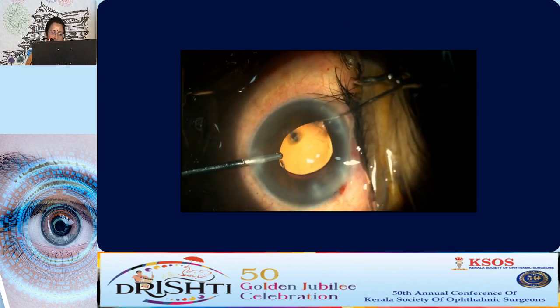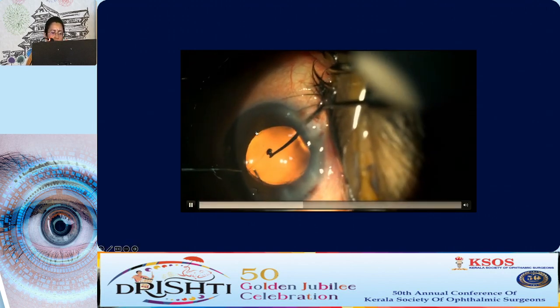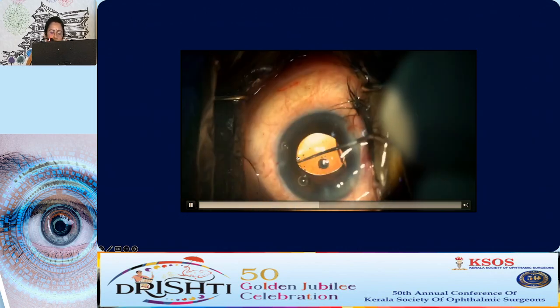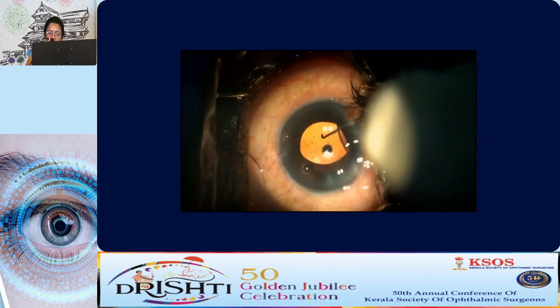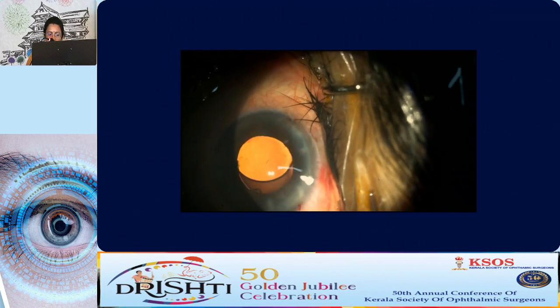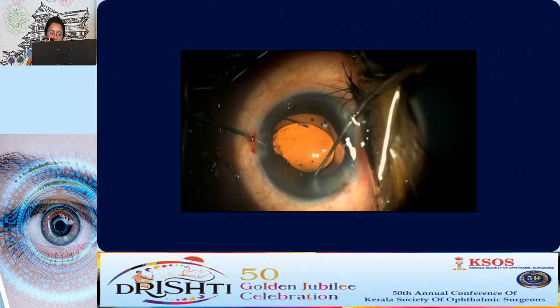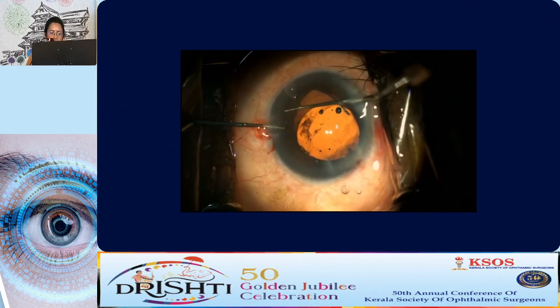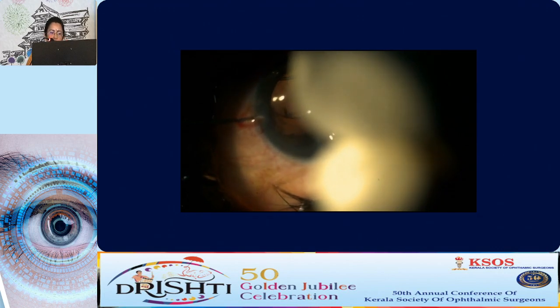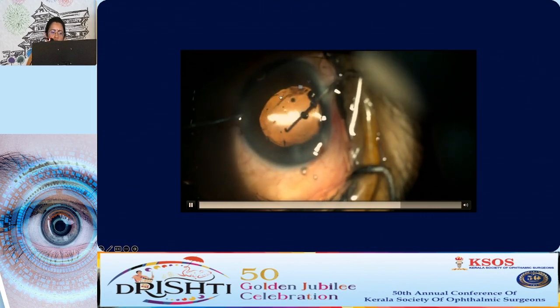or PCR. So here the optic was well inside the bag because you could trace the rhexis margin all around the optic of the lens, and there was no damage to the haptics. And then OVD was placed and then the CTR was injected. But again during OVD removal, the lens started to decenter. So I just dialed the lens out of the bag and then placed the haptics in the sulcus and then did an optic capture.